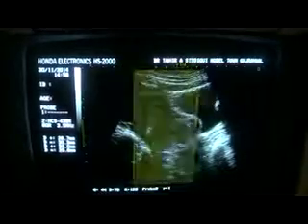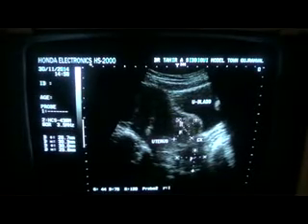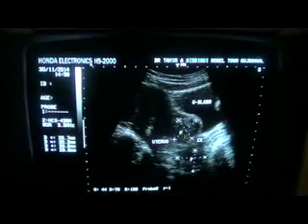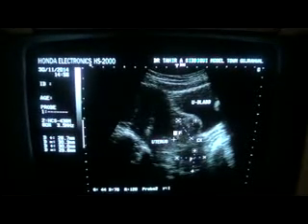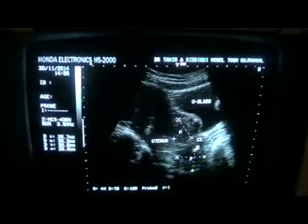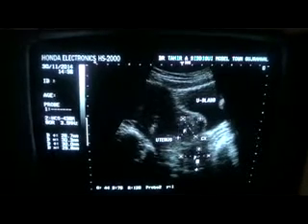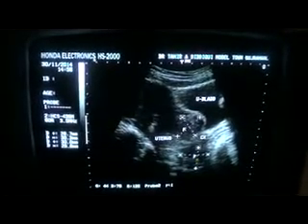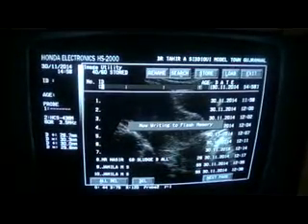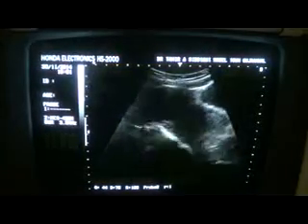And now this is the anterior myometrium, and this is the anterior lowermost segment of the anterior myometrium, where a subserosal fibroid of 30 by 25 millimeters is seen, and this is the cervical fibroid, which measures 26 by 30 mm. So let's proceed further. Now the upper segment, let's see what is the situation over there.